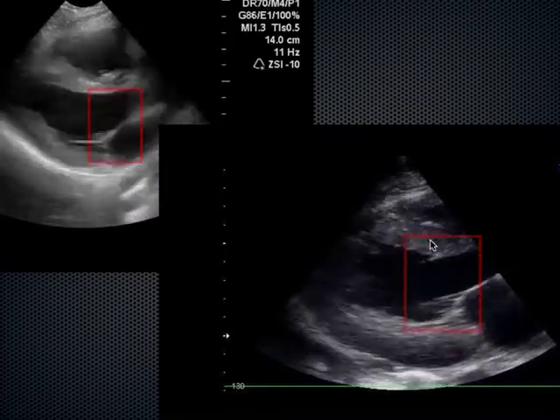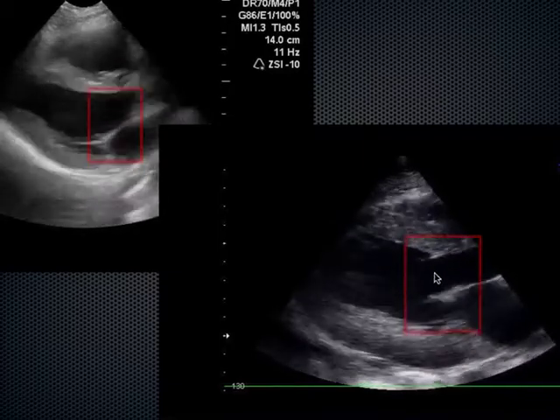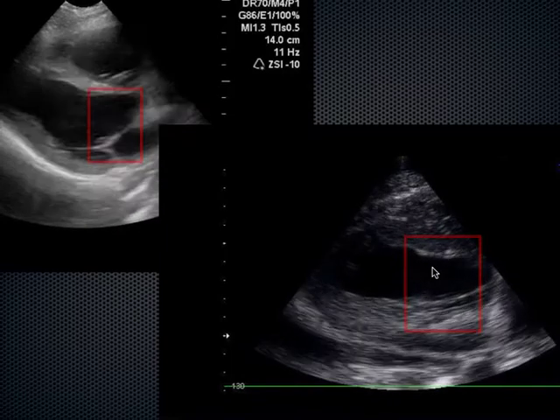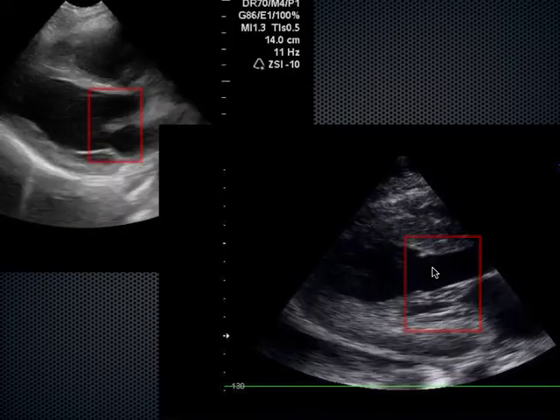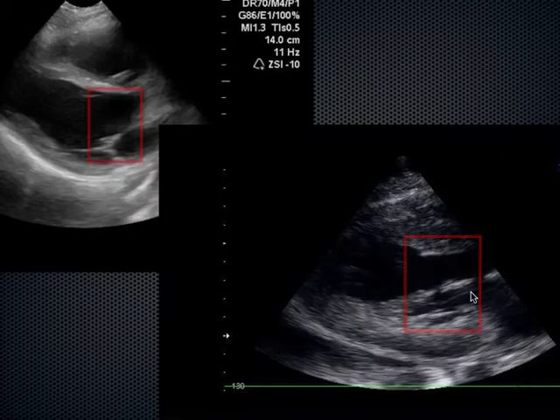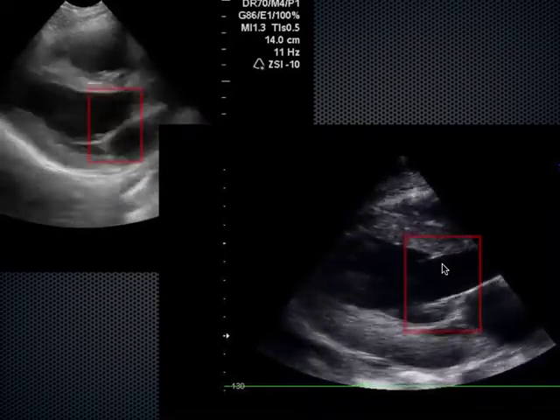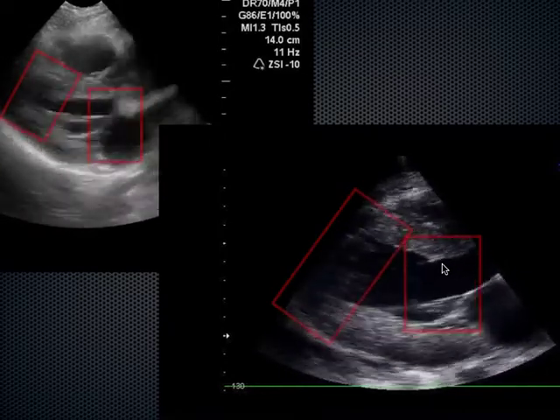And I think it's probably pretty easy for you to see that this mitral valve here is actually not coming up and smacking into that septum at all. And you can see, even as I freeze the image and back it up, it's really not making any meaningful headway. This is about as far as it gets, not even halfway across this opening to make its way towards the septum. So right off the bat, we're concerned about this patient having a decreased LV function, just because that valve doesn't come up and smack the septum.